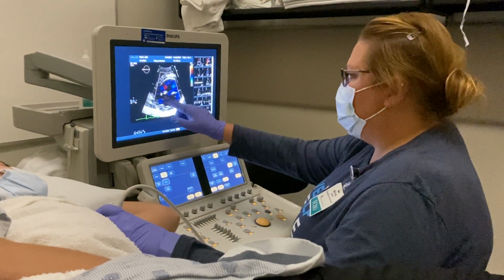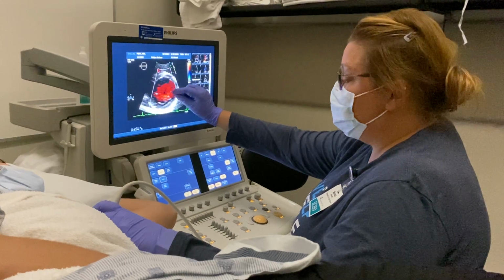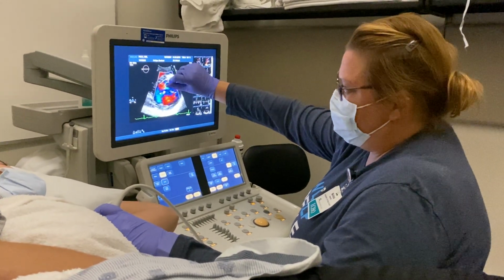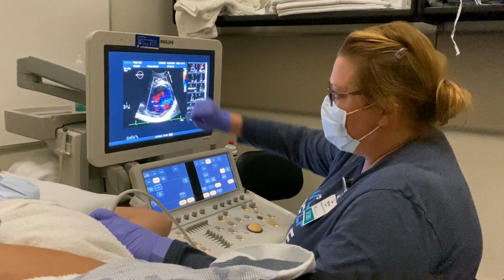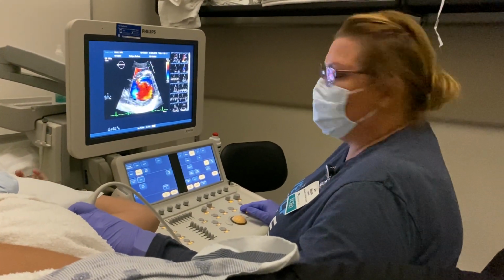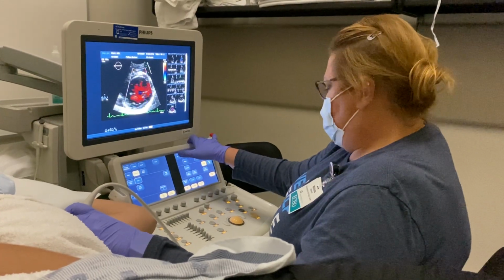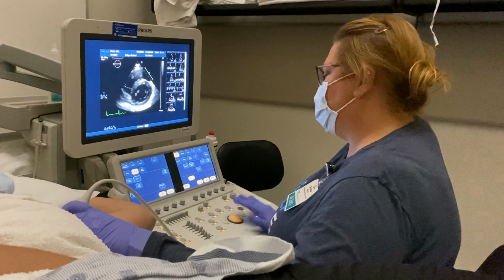I'm also going to look for regurgitation. Now if she had mitral regurgitation, it would be between the anterior and posterior leaflet. If you see aliasing of color flow up here above the anterior leaflet within the ventricular cavity, that is actually aortic regurgitation. Kind of remember from what I told you last time. All right, so we're going to click on 2D because 2D gets us home.